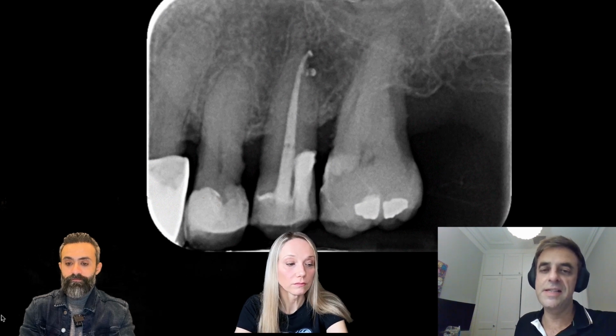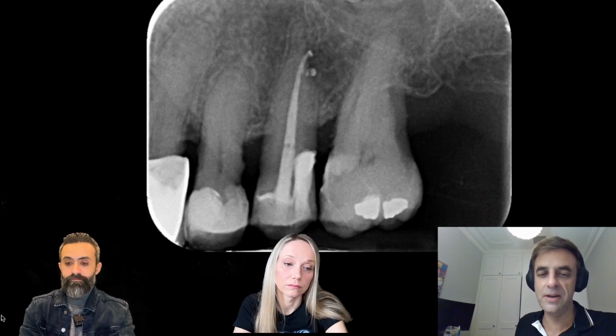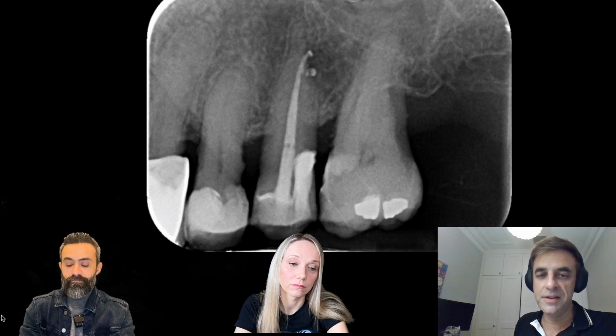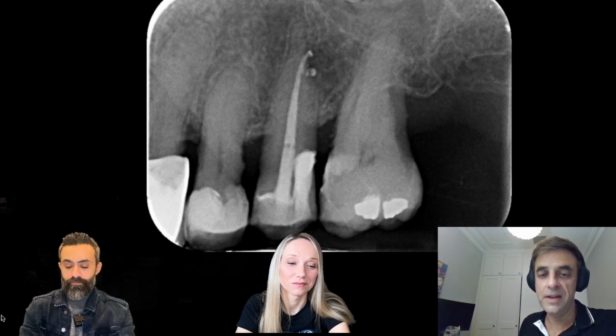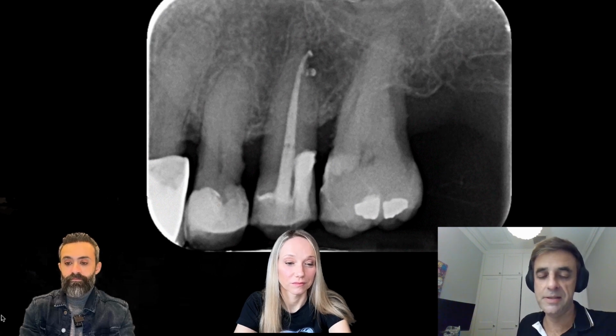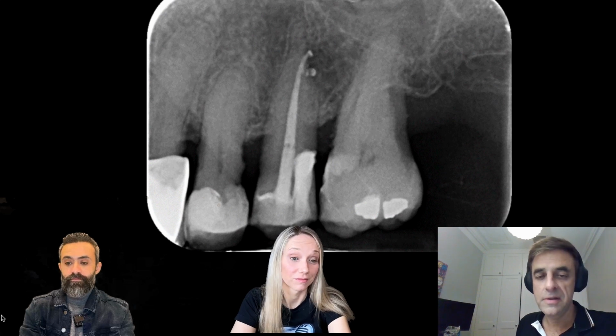But if you hadn't taken the CBCT scan, you may think there's some kind of extension of the root or there's an extra part you haven't cleaned out. You might even think there's another canal that goes to the radiographic apex there, but we know from the CBCT, there's just that one canal, and it finishes much short of the radiographic apex. And this is good to know.